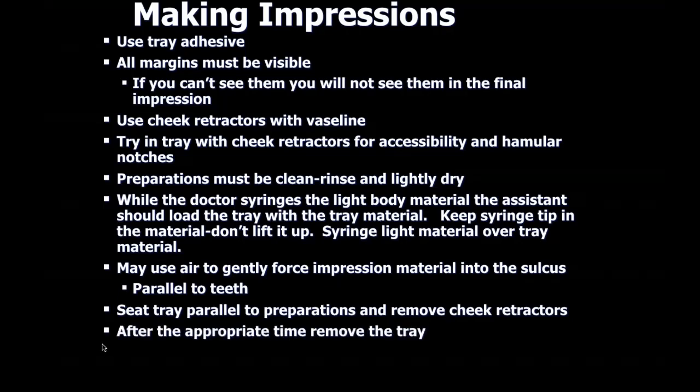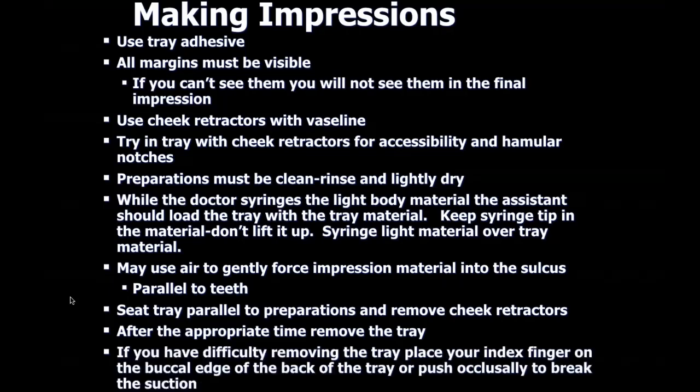Preparation. And then we actually time, and this is critical. Don't go by feel. Please have a timer on your operatory cabinet or have a timer in the operatory. When we say 4 minutes, we mean 4 minutes. Don't just go by feel. Make sure you time it, just like an etching. So you want to make sure you time it, you want to make sure you have good isolation, and you want to make sure you have good access and proper fitting tray.